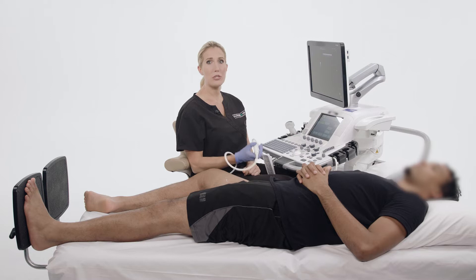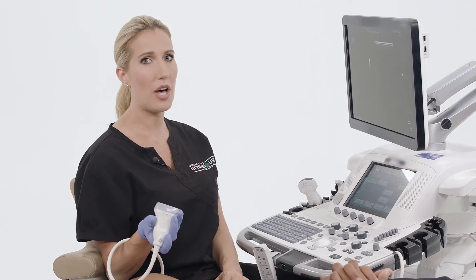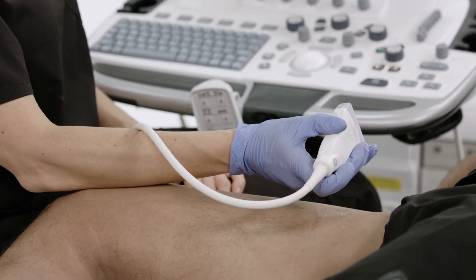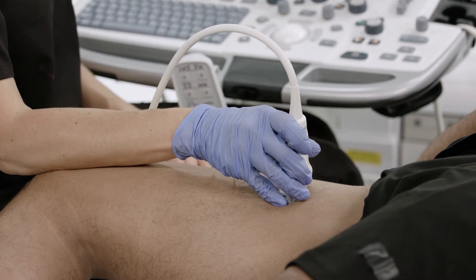I recommend using wedges for arm support. However, if there is not one available, a natural alternative would be to rest your arm gently on the patient's lower extremity. Do not forget to ask the patient permission before doing this.